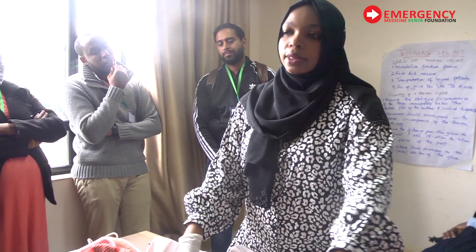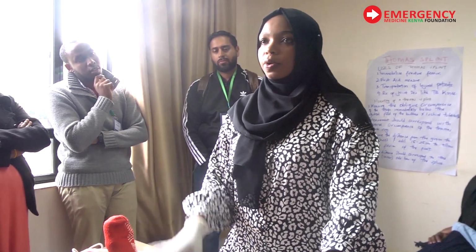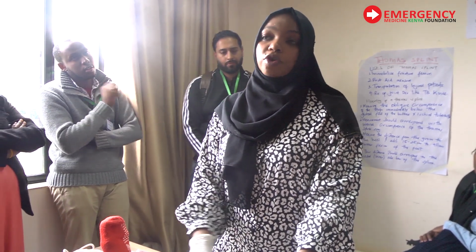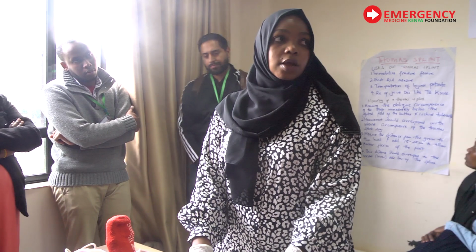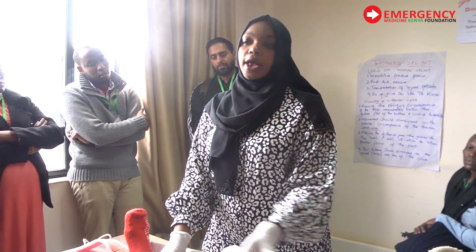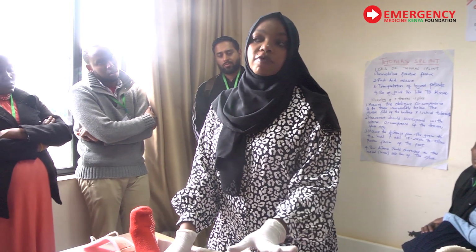Okay, so this is your 45-year-old man with a fracture femur, okay? So what happens? You guys have given boluses of morphine, you've given tramadol, so you want to immobilize. And immobilization means you have to reduce the joint, okay? Because there is an overlap and all that, so you have to pull your leg. At the same time, you have to immobilize. So when you do this thing, it's going to be very, very painful.